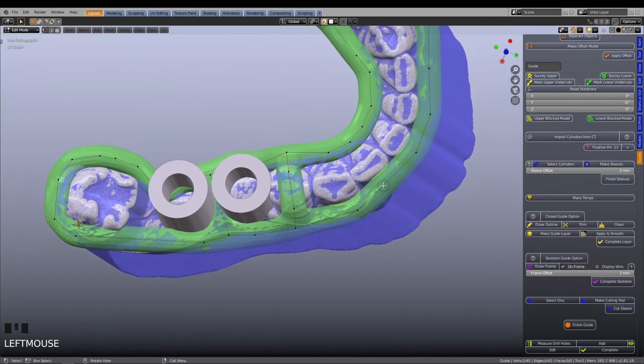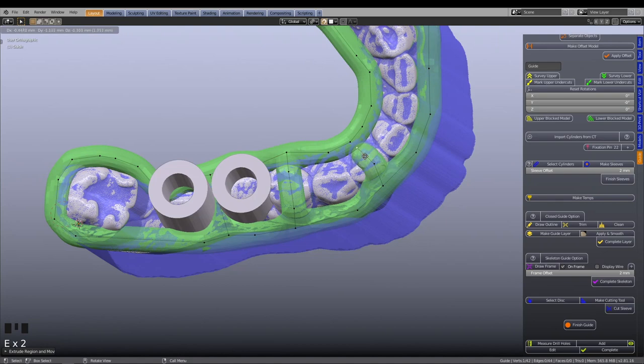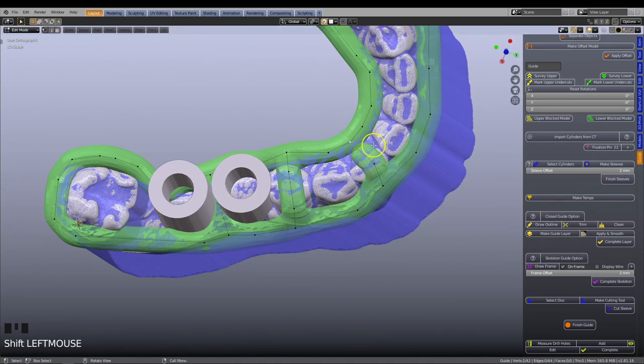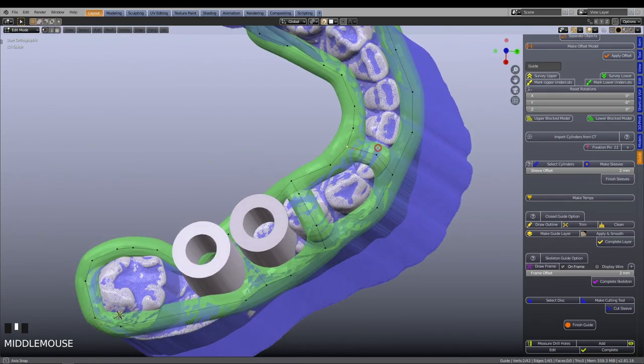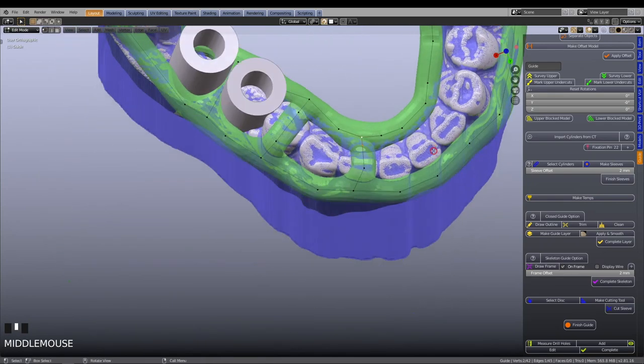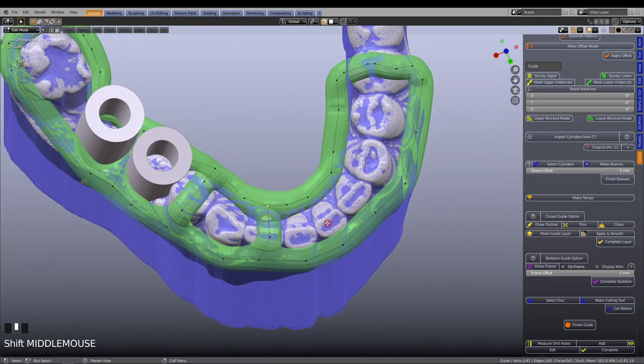Continue and repeat the procedure to add more lateral support structures to the frame. The guide should be well supported over the occlusal surface.